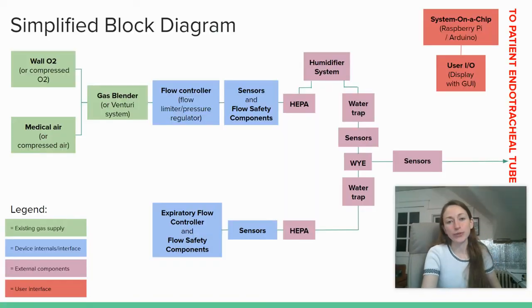To begin, I just wanted to go over this simplified block diagram that we mentioned in the last video. I think a lot of designs that are out there fall within this general scheme. If your device does not, don't worry, we'll still provide some tips that I think will be useful to you as well. But for now, we're operating under the assumption that the hospital will be able to supply wall O2 and medical air and has an existing gas blender for mixing those. But equivalently, you can make the assumption that you can use an O2 canister and compressed air and maybe a simplified dual venturi system for handling the mixing. All of that's still kosher.